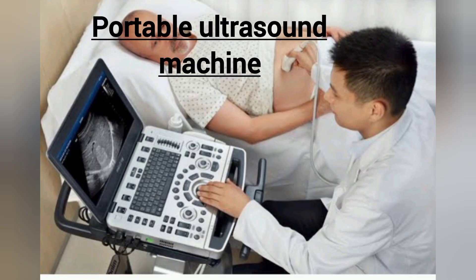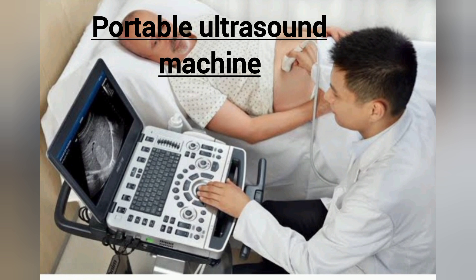The sixth equipment is the portable ultrasound machine. Like x-ray, some bedridden patients need frequent ultrasound examinations. To achieve reports faster and at the patient site, a portable ultrasound machine is used and is a must to keep in ICU.